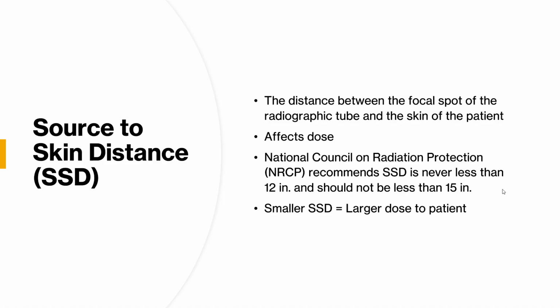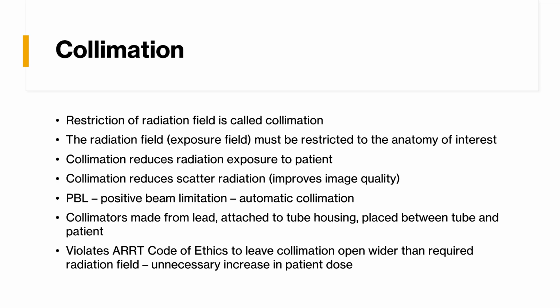So it's important to remember the general guidelines. It should be never less than 12 inches, and it should not be less than 15 inches. So like never 12, and should not be less than 15. Sometimes you can be a little bit in the middle, but there are pretty much no setups that you're going to have that are within that distance. Like I said, it's usually 40 inches and 72 inches. Depending on the thickness of the patient and their body habitus, it'll be a little bit less than that because it's just the source to the skin.